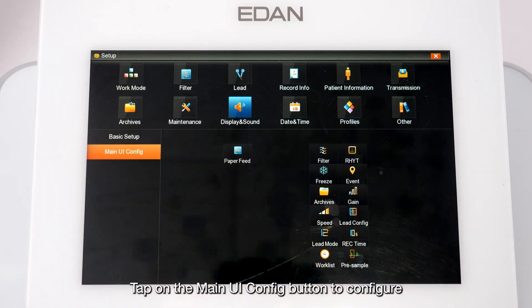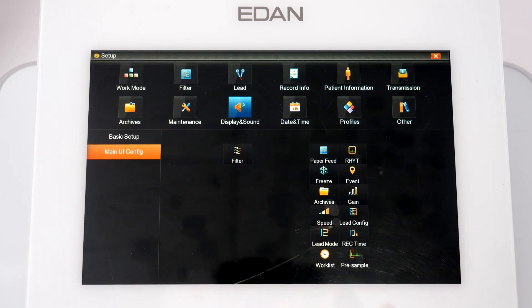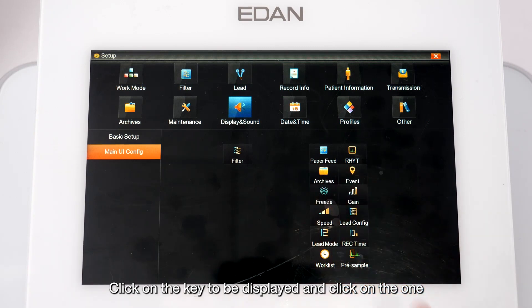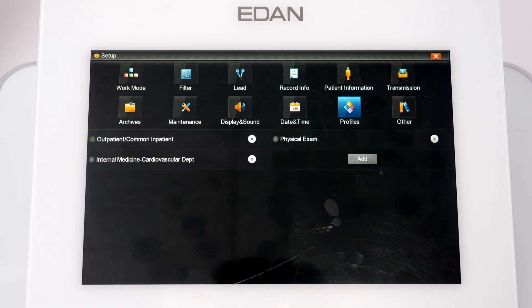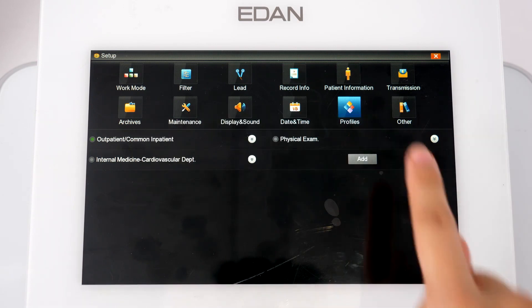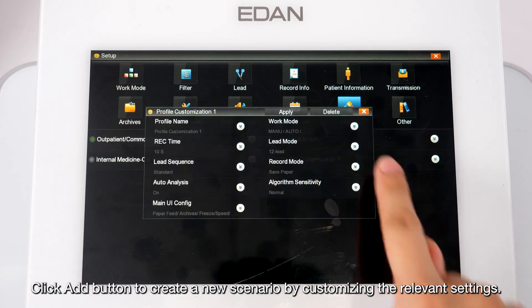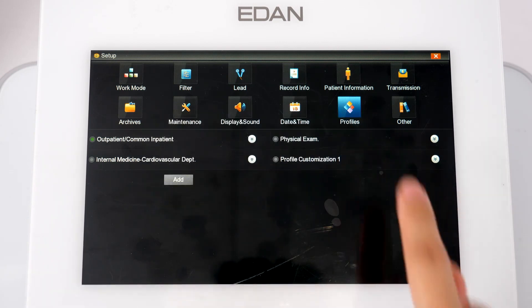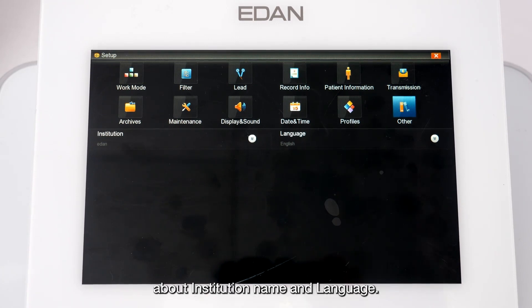Tap the Main UI Configuration button to configure 12 function keys to be displayed on the main screen — click the key to be displayed and click the one you want to remove. In the Date and Time screen, you can change date and time settings. In the Profiles screen, three usage scenarios are provided; click Add to create a new scenario by customizing relevant settings. In the Other screen, you can change settings for institution name and language.